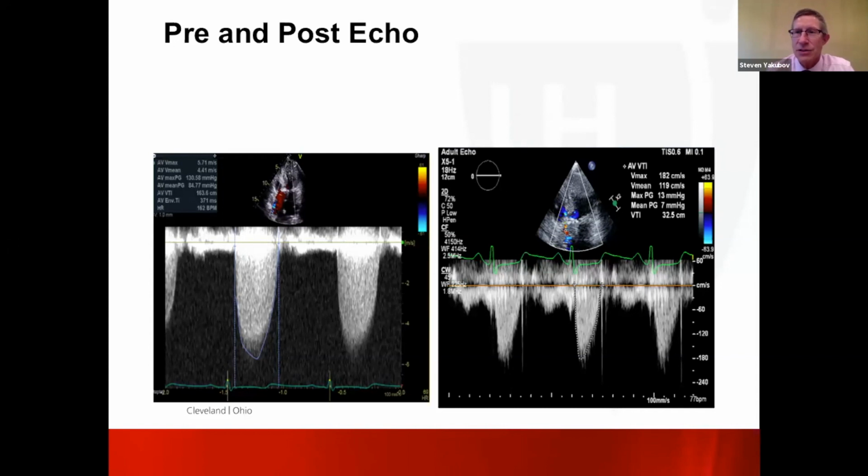But I just wonder, the valve is designed to be open somewhat in a circular configuration. I know the annular dimension is not reflective of coaptation of the leaflets perfectly, but it is somewhat affected. And you just wonder, will the stent frame deformity at the annular level affect the long-term outcome of the valve?